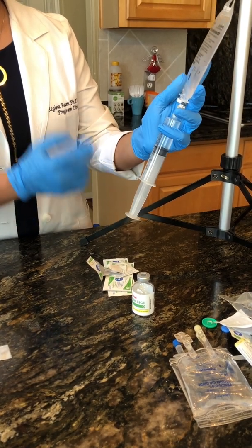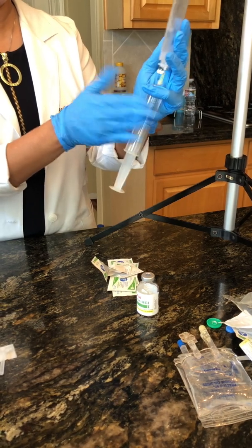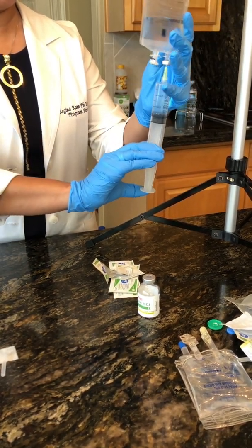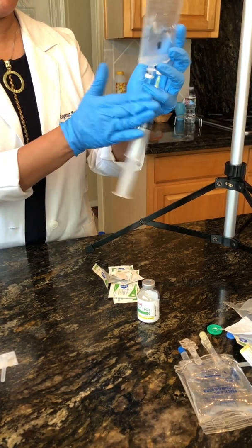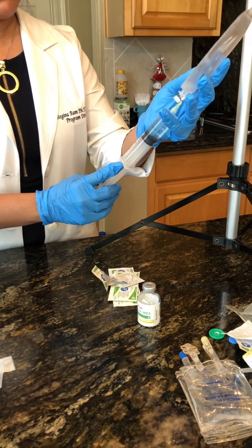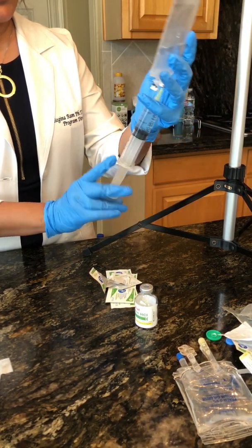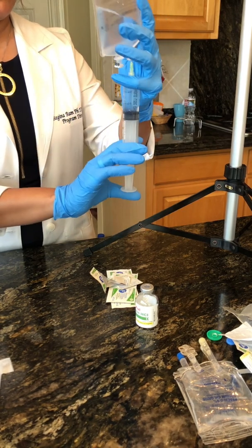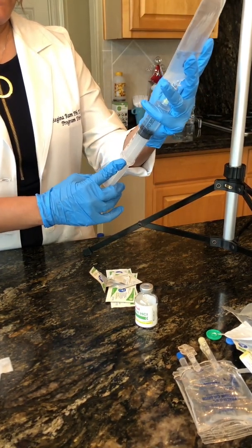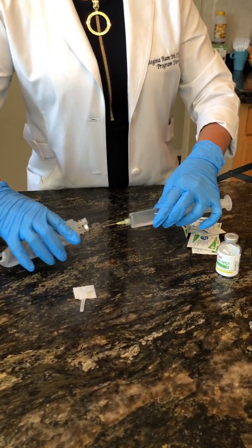Before I remove the needle out of the IV bag, I'm going to go ahead and tap. I want the large bubbles to be removed. Making sure I'm still at 20. Go ahead and remove.